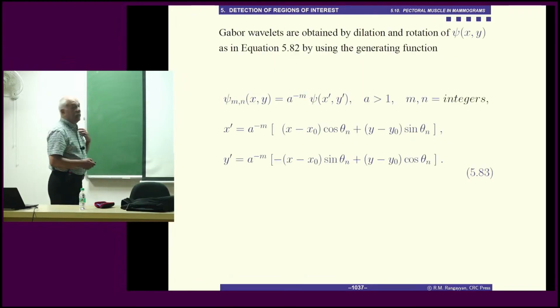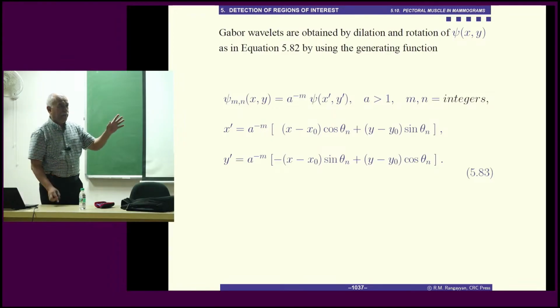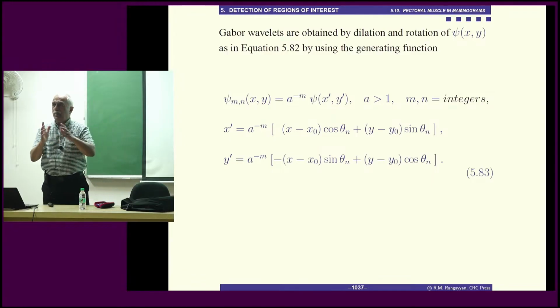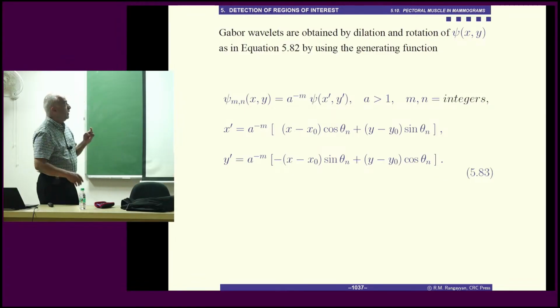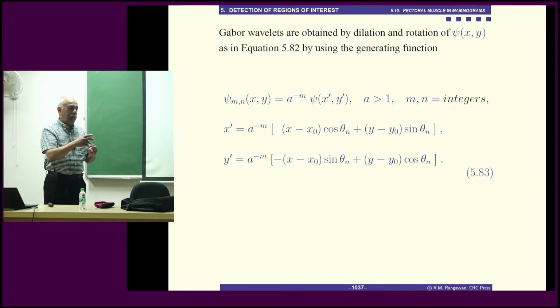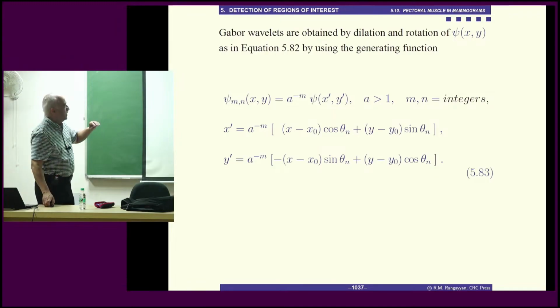Then you can dilate, you can treat these as wavelets. You can also treat it as just a function. Take the Fourier transform, you get a band pass filter. There are the scale factors, you adjust them, and you will see the band pass nature of the filters in a moment. And you can use whichever filters suit your application. You can have as many as you want and make a bank of multi-scale, multi-orientation filters. But in this case, for his own interest, Ricardo said we will use the wavelet formulation. It doesn't have to be so, but that's what he did.